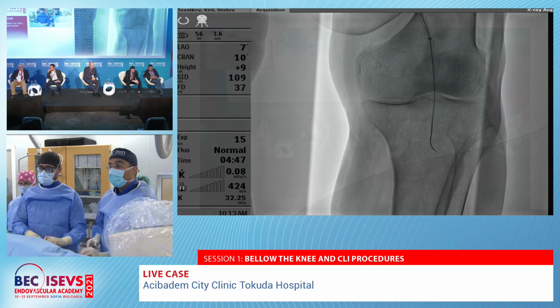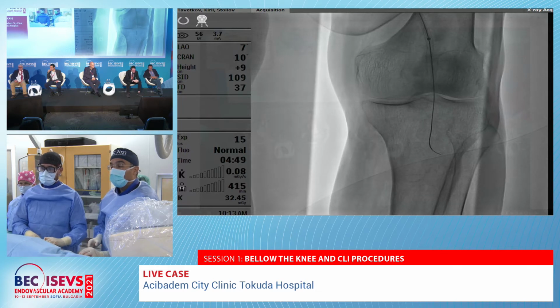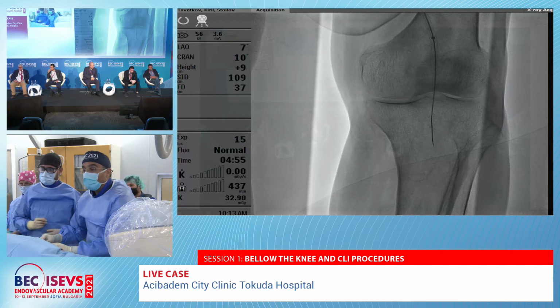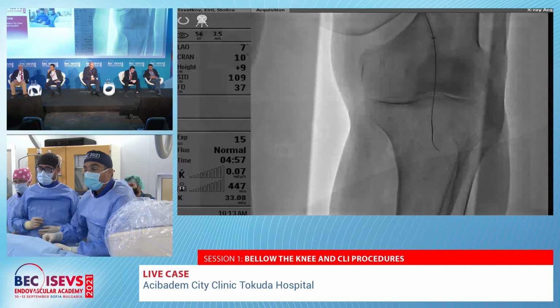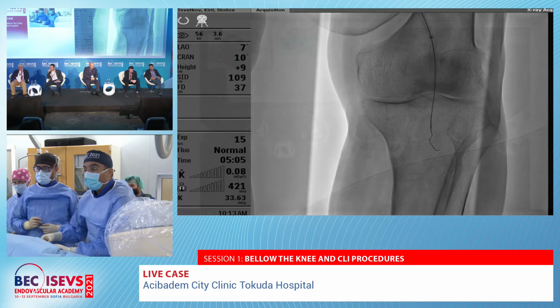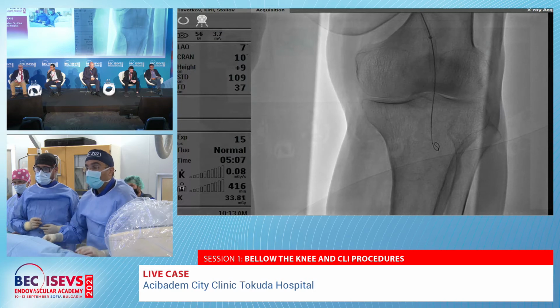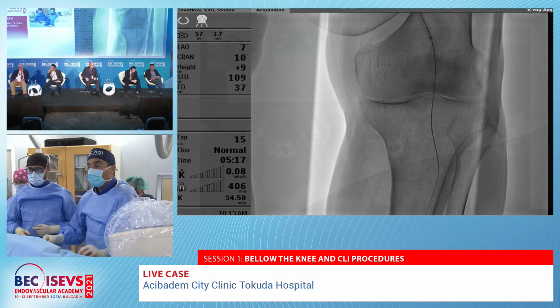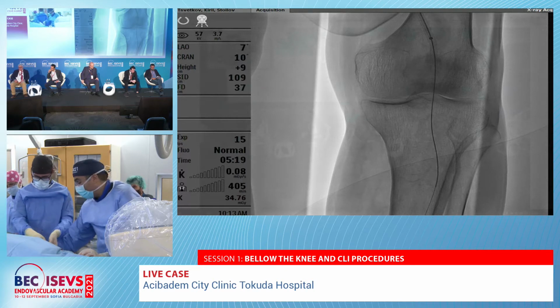It's good. Some insight regarding the wire you are using? Perfect. Command. Here, this loop is not really the best thing that you have to do. Let me go a little bit with a loop. This is probably the cap that you have to penetrate, and then you are probably right in the fibular artery. That is what we want. Go a little bit distally.